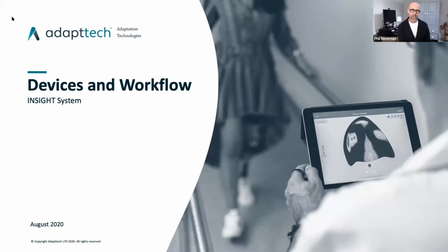This is our second training session today in relation to the INSIGHT system. And this is going to be very different to the online sessions that we've run with you guys before. This is very much about the practicalities of how the system works, and it's kind of pseudo trading ready, so you can go to the clients and start helping them with their sales inquiries and likewise their technical inquiries. So today we're going to be talking about the workflows associated with the INSIGHT system.